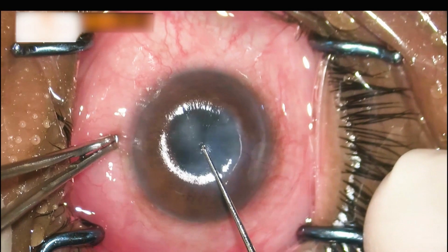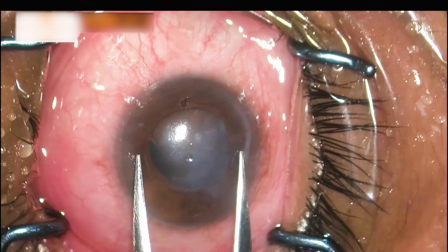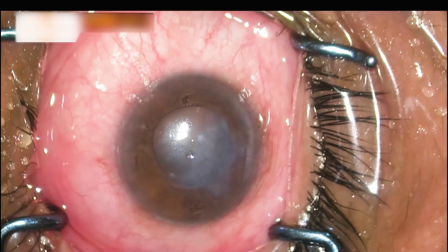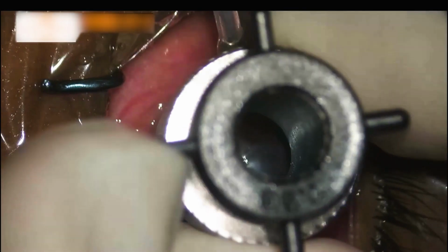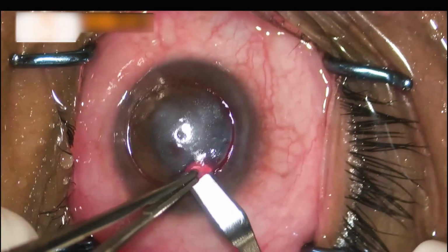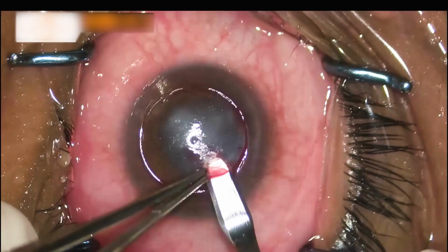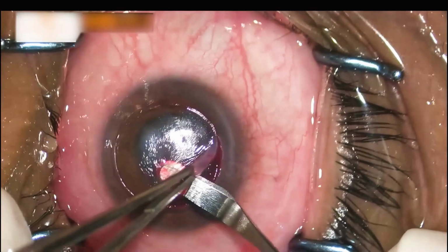Centration is marked using the dialer. A caliper is used to determine the size of trephination. Partial trephination up to a depth of 80% is achieved using a vacuum trephine of 7.5 mm size. Bleeding is noted from the deeper vessels. A crescent knife is used to partially debulk the stroma.